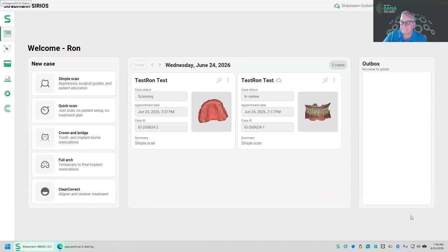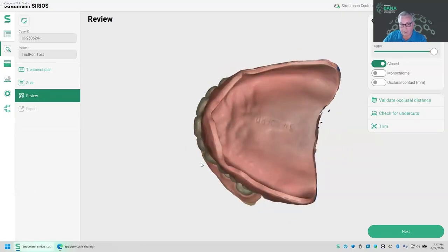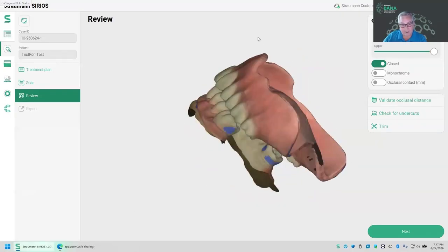Thanks. Here's another one. You scan the palate of the smooth denture, but had a hard time creating a perfect image. How long does it take to scan a perfect palate image ready to send to the lab? Of the denture, I would say this one is ready to send to the lab, because this surface is the critical one, and I would say that's perfect. The flange here is about as good as it gets.